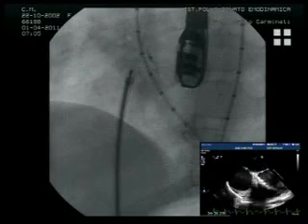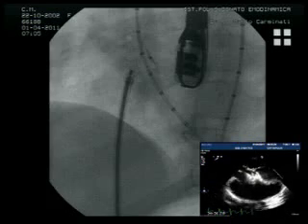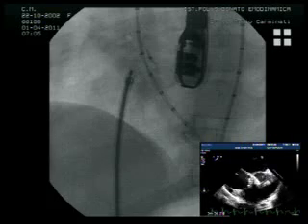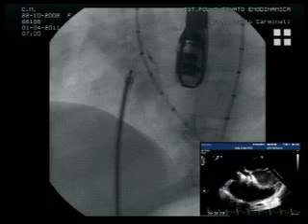That was very good. Dietmar has got a comment or a question for you. Good morning, Kevin and Mario. Do you have a special technique for applying the right-sided umbrella to avoid the tricuspid involvement? So, did you start with the deployment of the right side?